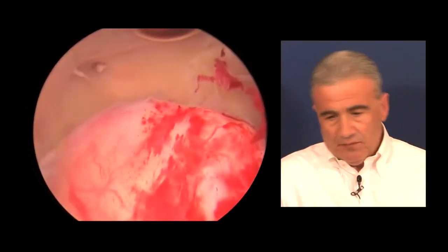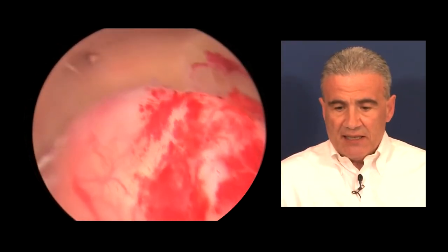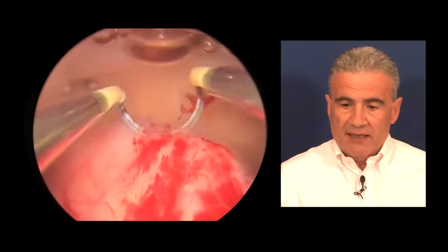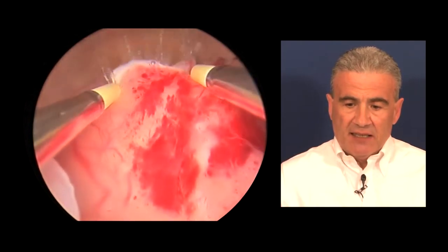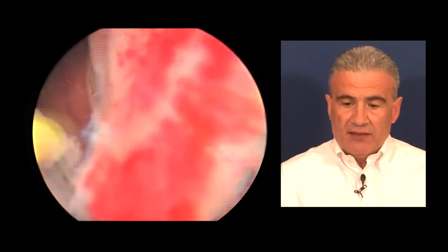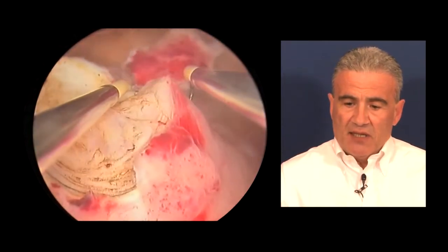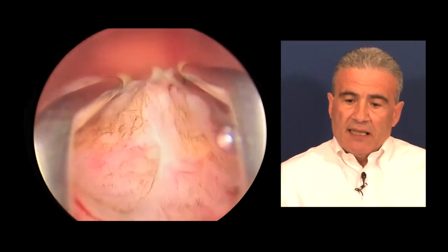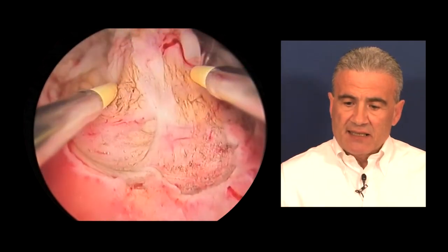The patient undergoes a combined myomectomy both with the resectoscopic technique and by using mechanical instruments in the operating channel. Now we see the image of the myoma. It is a myoma G2, which occupies the majority of the back uterine wall. It is initially attacked with the curved electrode of the resectoscope. We see how the first fragments of myoma are extracted in order to reduce the intracavitary portion of the myoma itself.